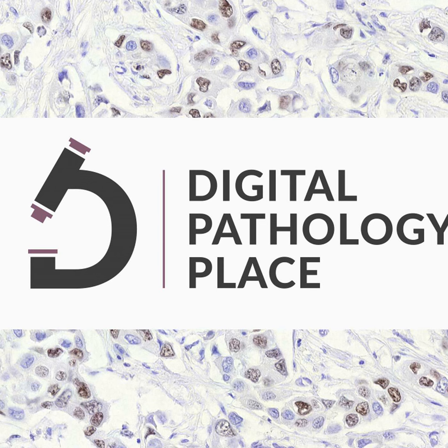So in DICOM, we decided to create a very efficient representation that's specific to the digital pathology task and intended to scale to millions of objects. It is a contour-based format that outlines the locations either on the slide relative to the image or in a 3D volume on a series of Z-stacks. And it's specifically intended for the computational pathology and whole slide imaging use case.